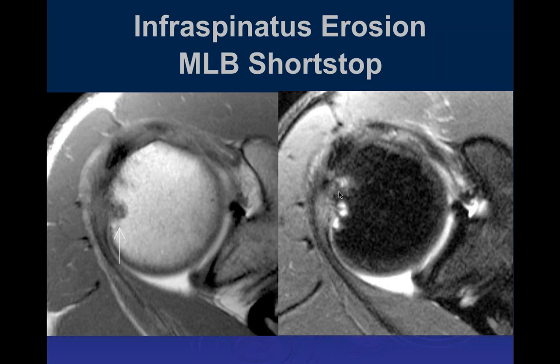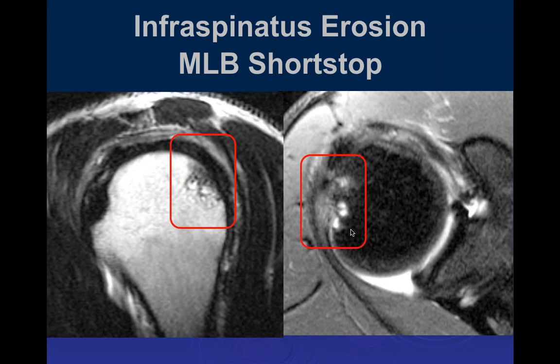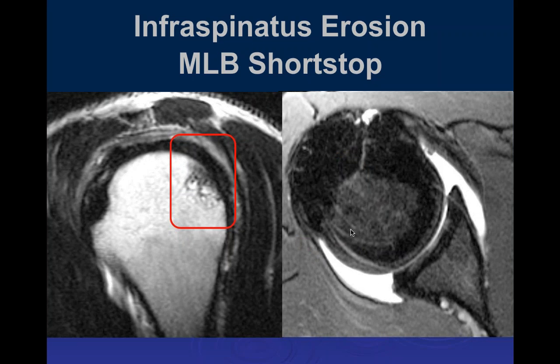And this is really a chronic traction injury, and we see this all the time. I think we probably see it in everybody over the age of about 40 or 45, but we see it much earlier in younger athletes who do a lot of overhead activity. So that's just the traction injury, and this is what it looks like on the sagittal images.